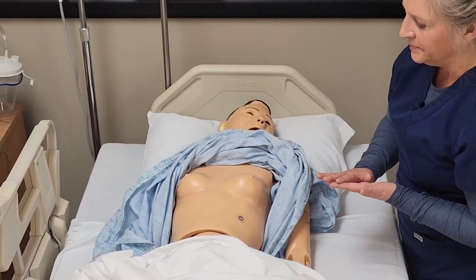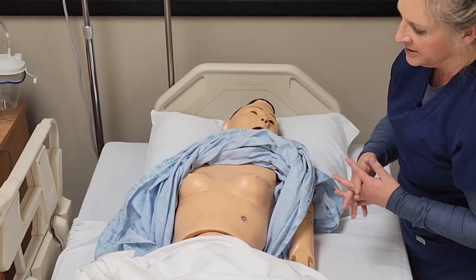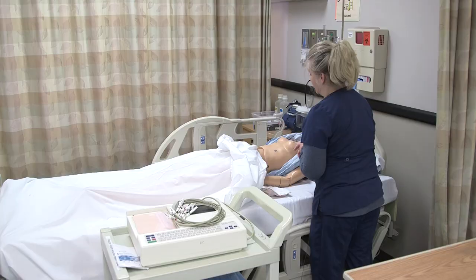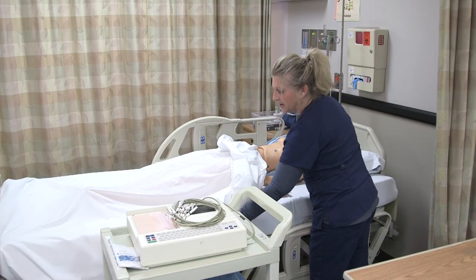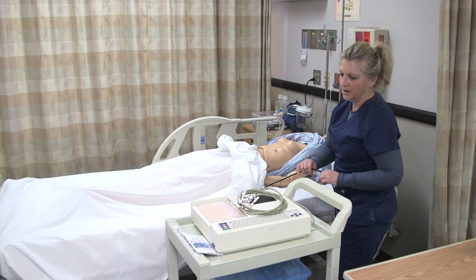Also, if there's any hair that is interfering, make sure that we can clip that or try to find an area close to where we're going that won't interfere. But typically if we have to clip the hair, we should, so that we have good conduction of our electrodes.